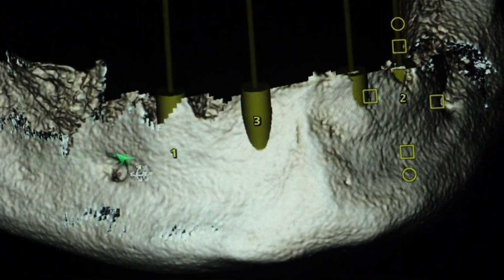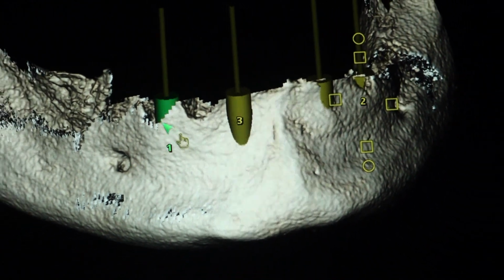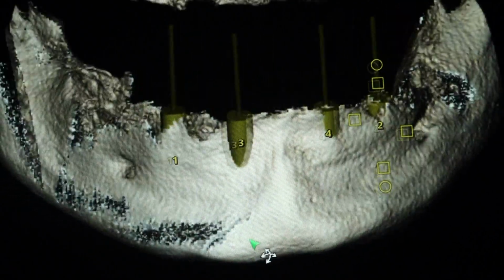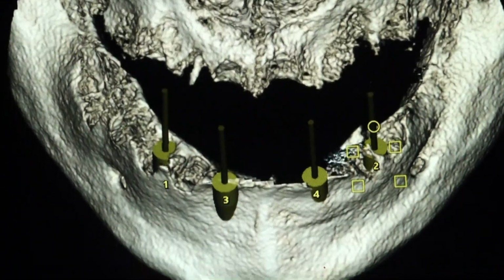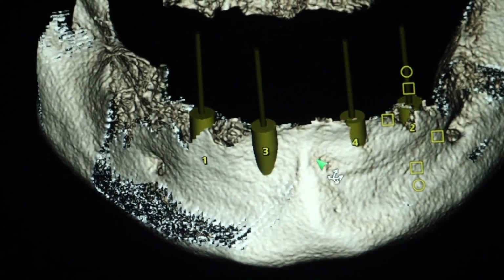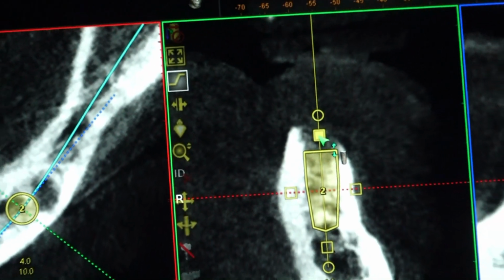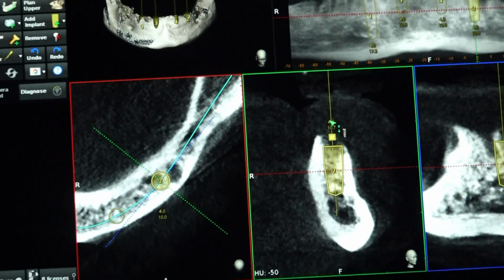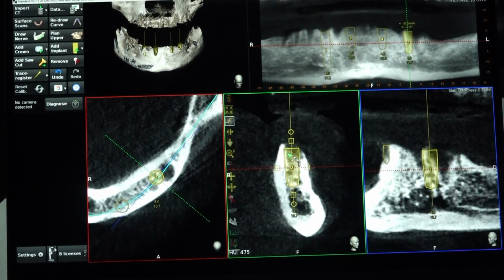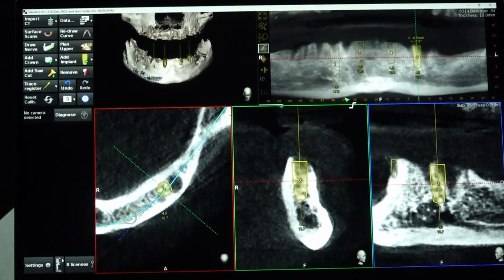So in this technique you don't have to expose the mental foramen fully. You just need the landmarks for the first premolar. If you know the first premolar socket, you can place 2 axial implants and 2 axial implants in the anterior near the laterals. Technically it is much less sensitive, less time consuming, less risk of injuring the nerve. But if you give tilted, the mechanics are better.